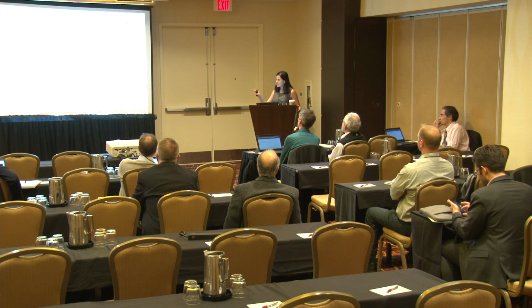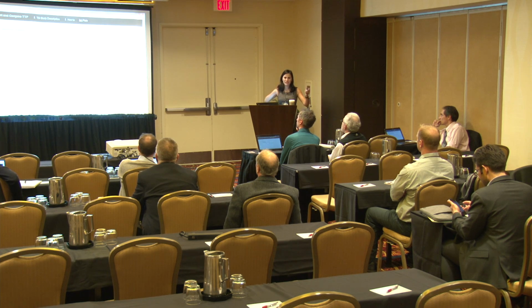So just for this example, when I do the comparison, I will be uploading a subset of the data, just so we see HRZE from that specific study. But next week I'll be adding this option where you can subset for a specific study, so you don't see all results together.